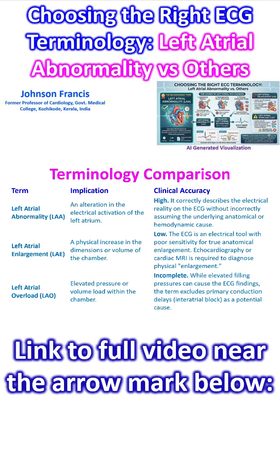Terminology comparison. Left atrial abnormality: the implication is an alteration in the electrical activation of the left atrium. Clinical accuracy: high. It correctly describes the electrical reality on the ECG without incorrectly assuming the underlying anatomical or hemodynamic cause.